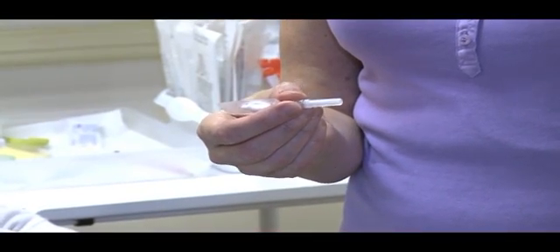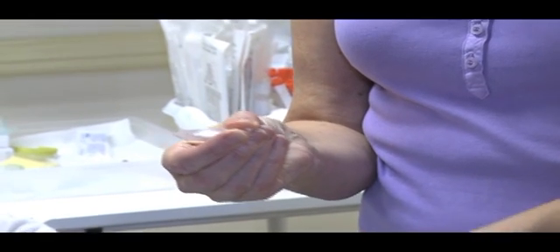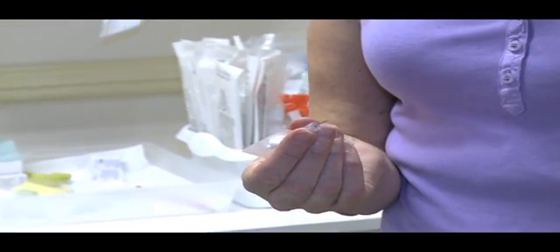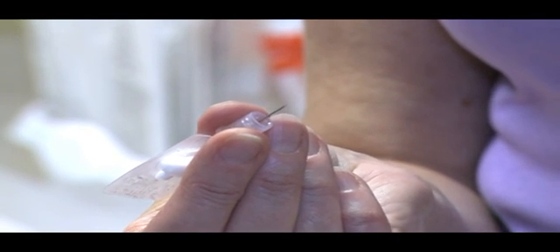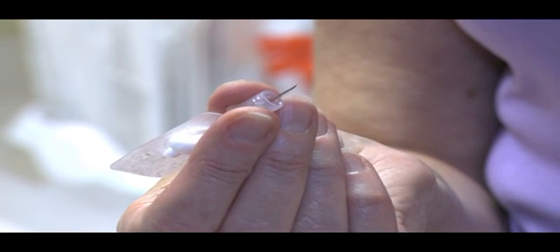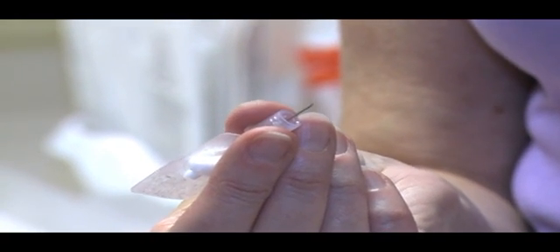Continue to hold the injector firmly by the port. Pull the needle shield away to reveal the needle. Hold the injector in the needle-up position until you are ready to deliver the dose to avoid any possible dripping. Please note that there is a small overfill in the reservoir, and if a little dripping — one or two drops — does occur, then as long as the reservoir is emptied, the patient will still receive the correct dose.